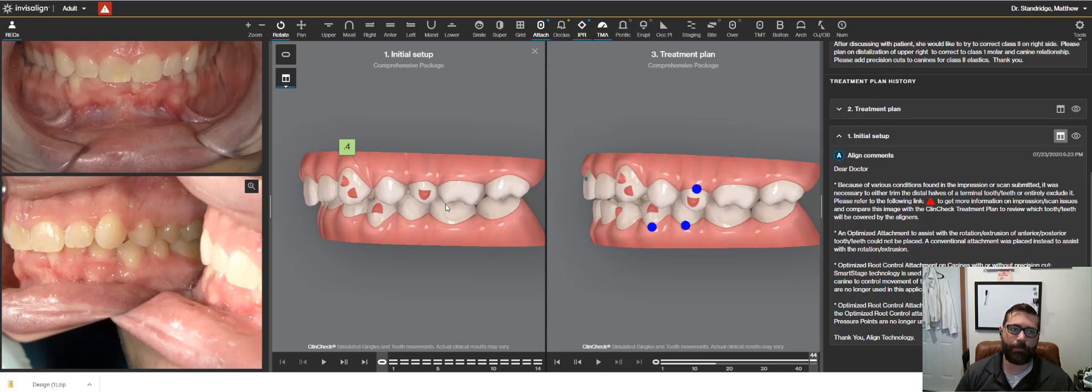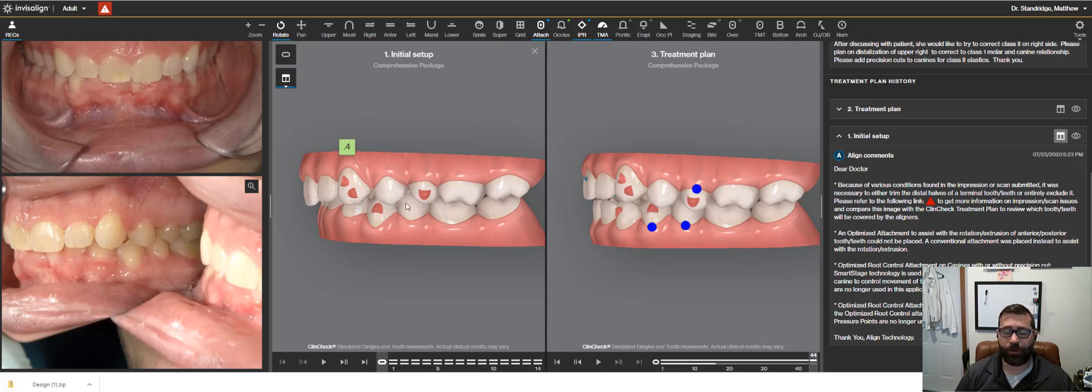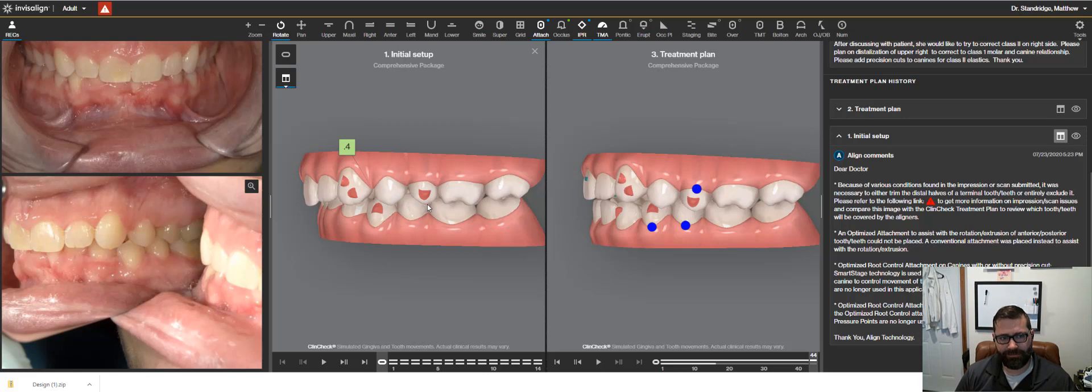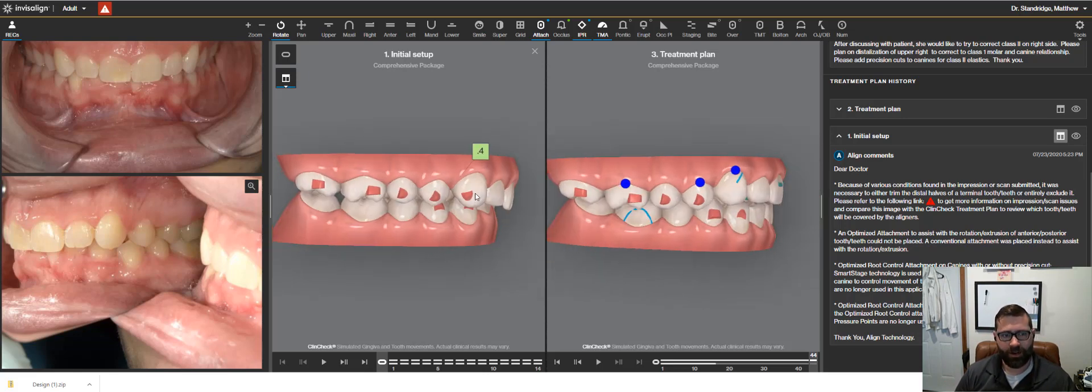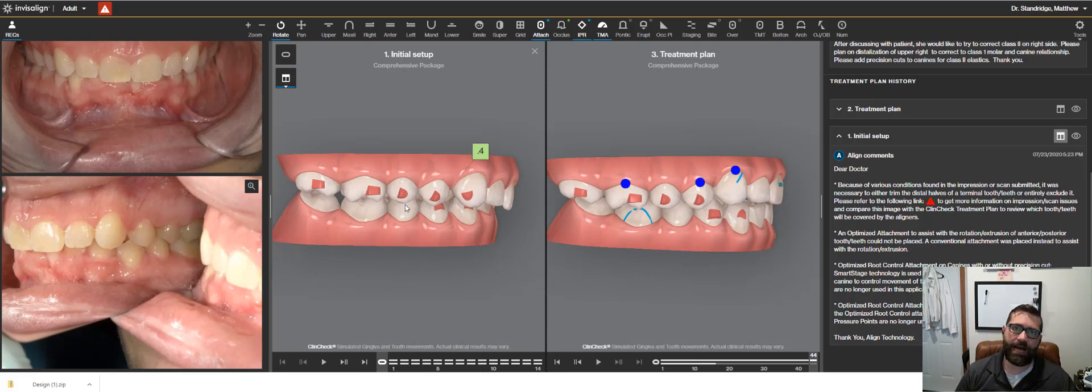And not just that, but also we're looking at the premolars and canines fitting within embrasures here. We're pseudo class one, but over here on her right side, we are about a full half step class two.